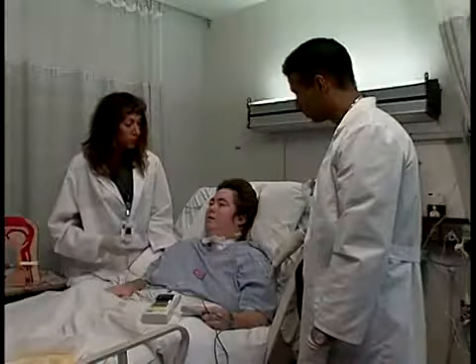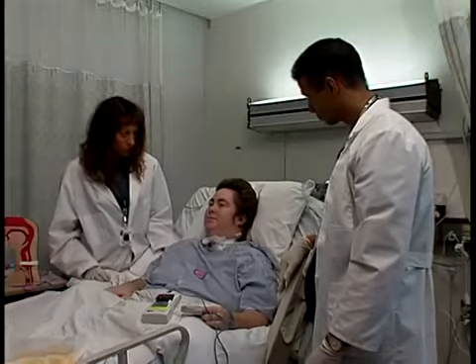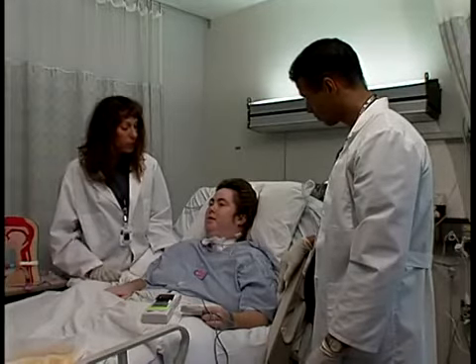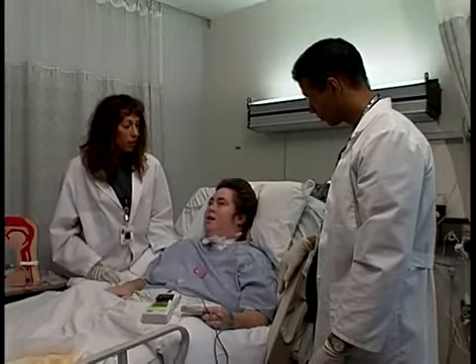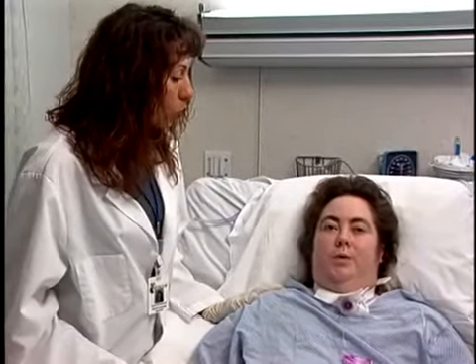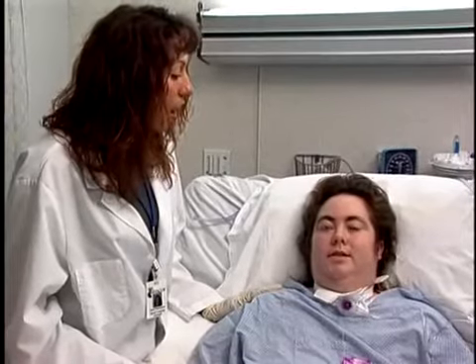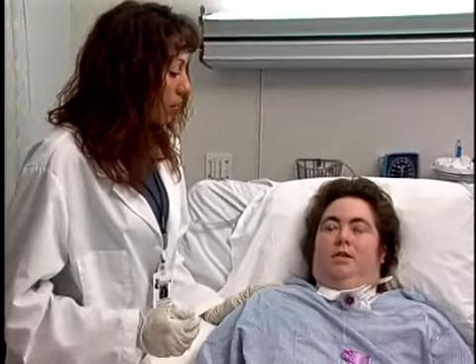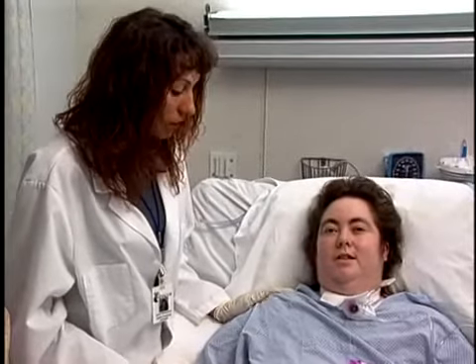If the patient appears to be tolerating the valve, they should be encouraged to exhale through the mouth. Have the patient attempt to vocalize an "ah," count to 10, or repeat some simple phrases and sentences. Many patients will be able to speak well after the valve is placed. However, other patients will need to practice these simple activities to improve their speech and voice production. This may be due to vocal cord atrophy, damage, or neurological deficits.